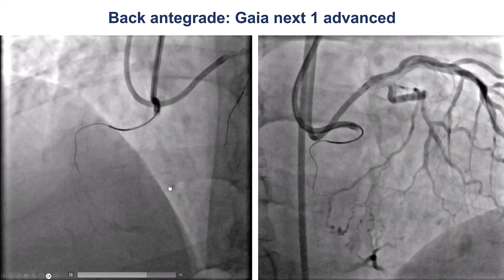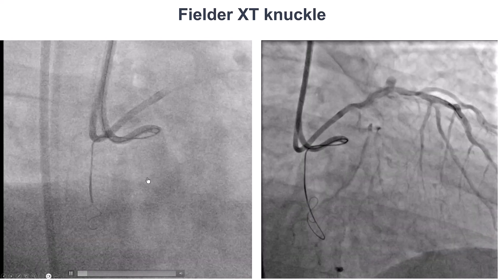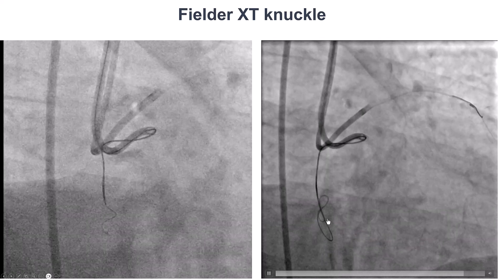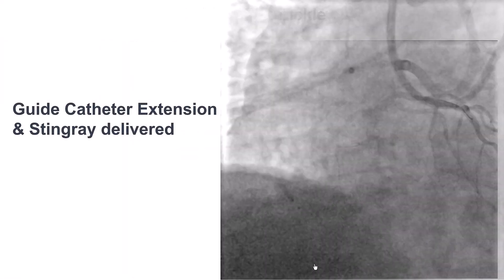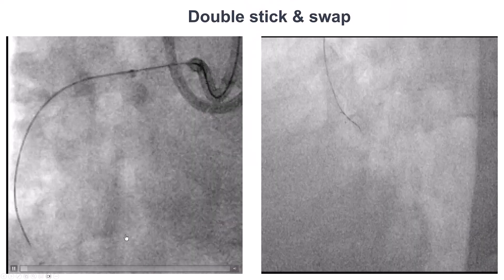We went back to antegrade crossing. We used a Gaia Next 1, which seemed to advance, and then eventually switched to a Fielder XT that knuckled and appeared to be tracking well with the vessel. We used the guide extension to minimize hematoma formation and delivered a stingray balloon, trying to reenter.